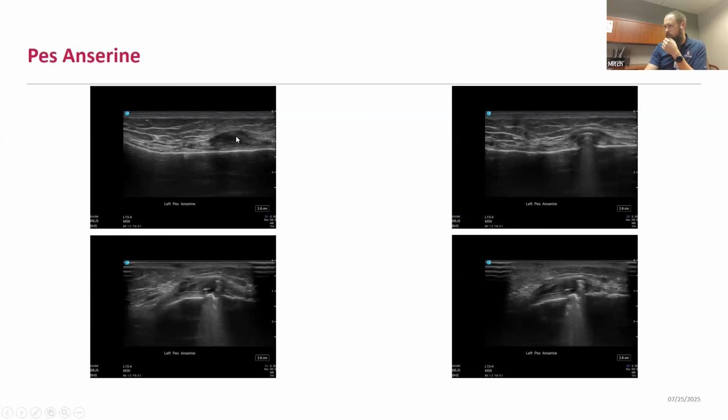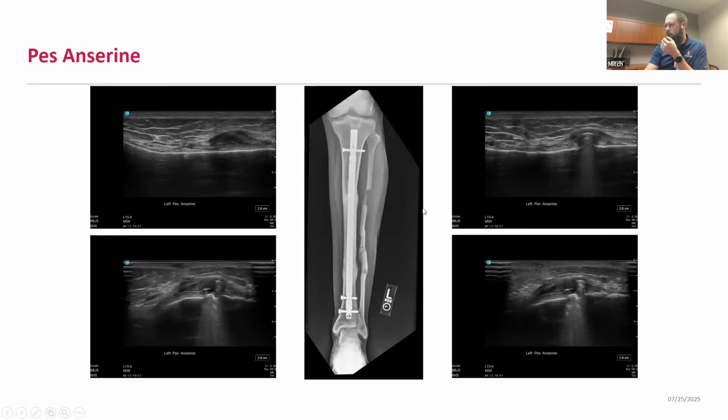So as I scan more lateral from this bursa, I start to see this very hyperechoic structure with deep shadowing present in this area, both in long axis and then short axis view again. And so again, going back to the initial case, this patient had underlying orthopedic hardware. And what we're looking at on the ultrasound here is a proximal interlock screw protruding from the tibial cortex that then is putting mass effect and mechanical irritation on the Pes, which was likely contributing to his symptoms.